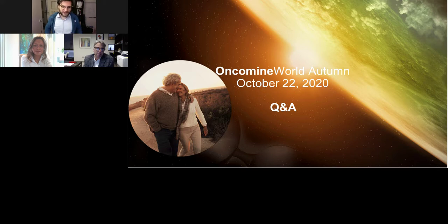All right, appreciate that. Jane, I'm not sure if you want to add anything on that. No, I completely agree. I think there are definitely some advantages to the NGS approach, and there is value in FISH, but I think it is really more in the context of looking at the spatial relationship, things that are really more in the research field, like the spatial heterogeneity of these fusions, for example. But if the point is to detect the fusion or these rearrangements, then NGS is really the way to go.